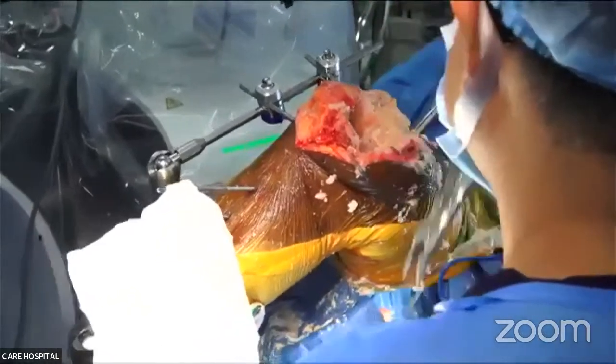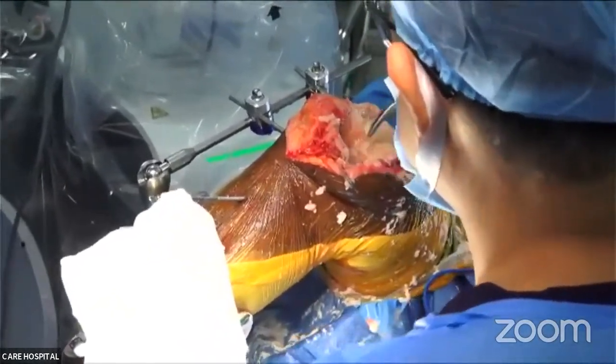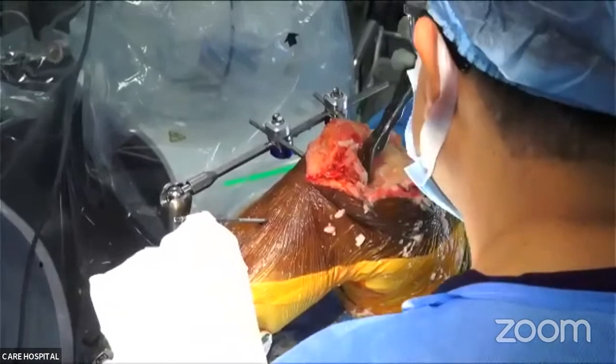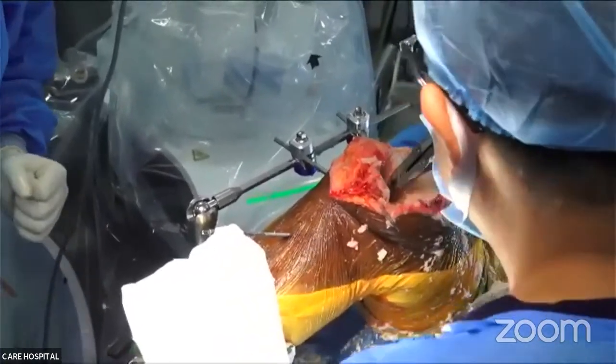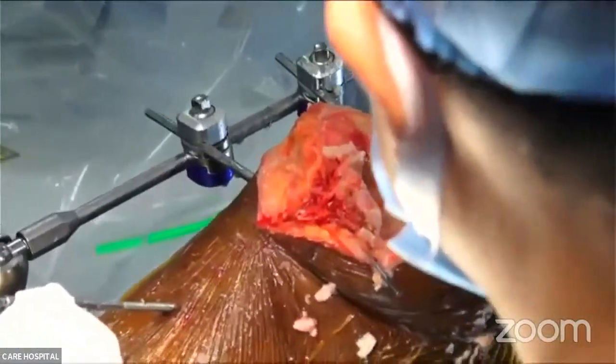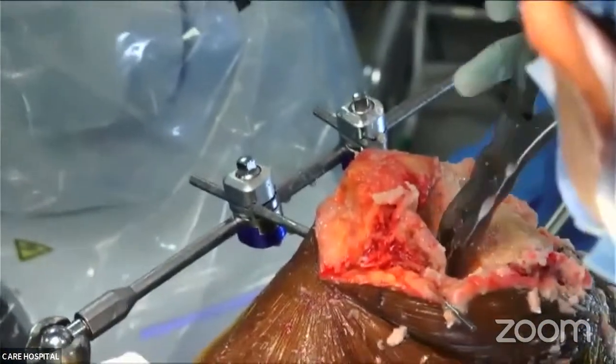We can take the tibia cut first and then go back to that. So the tibial eminence is coming in the way. What we can do, we can take the tibial cut first and then go back to the femoral cut and take the remaining cuts then. Have a look once, if it works, fine, otherwise we do it that way.